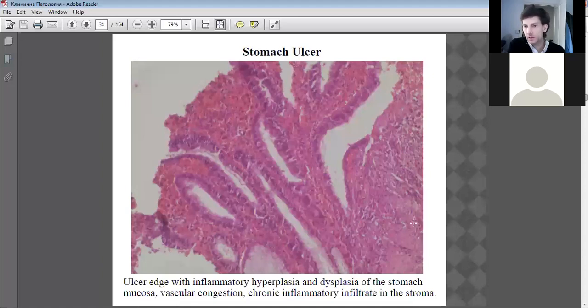You can see towards the right, you can see the fibrotic tissue, the fibrous tissue trying to migrate to the surface. Here, probably we've got a nice example of still a bit of healthy tissue there, okay? Still a little bit healthy, but eventually it's going to be degraded, as this part is actually a lot of loss of the cells there, a lot of atrophy.